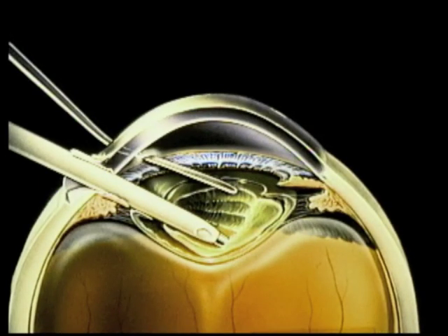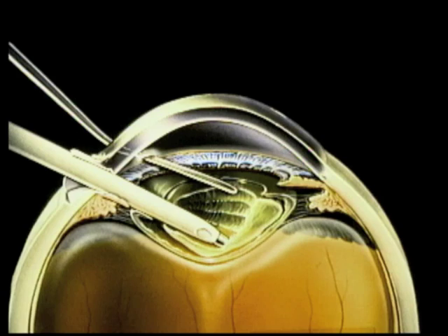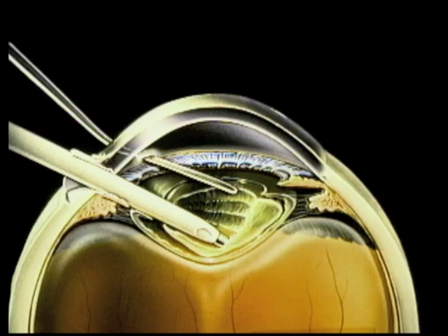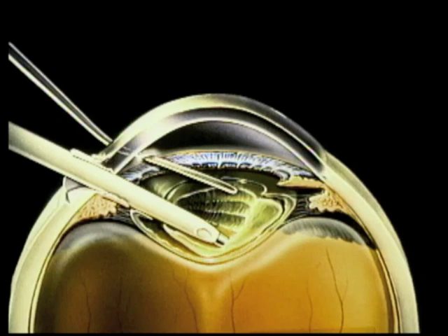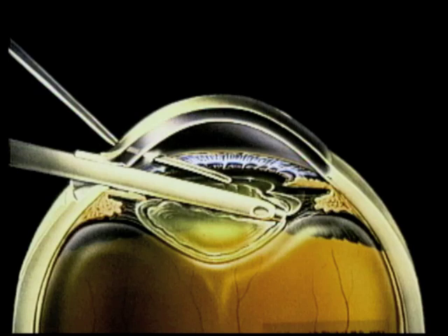The change from traditional sculpting to downslope sculpting is a subtle one. The sculpting is done mostly in the upper two-thirds of the central nucleus by nudging the nucleus inferiorly. Complete hydrodissection facilitates this move. If the sculpting is done in the upper pole of the lens, superior to the center, it reduces the chance of a posterior capsule rupture with the phaco port during sculpting. With traditional techniques, if the nucleus is broken through unexpectedly, the tip is somewhat more perpendicular to the capsule because of the upslope capsule inferiorly.